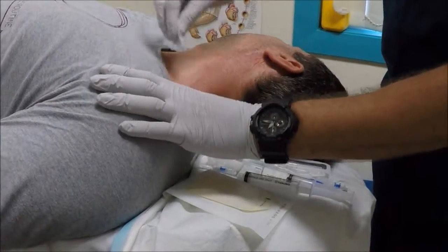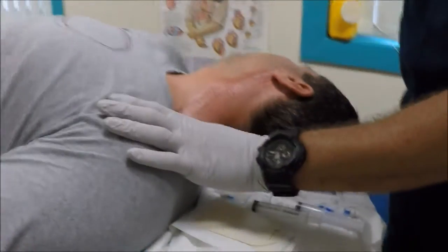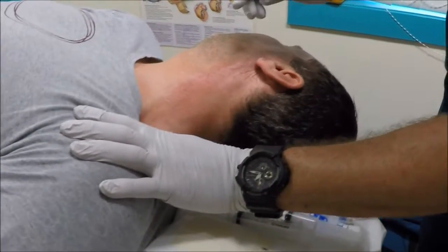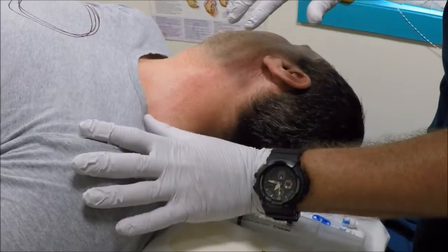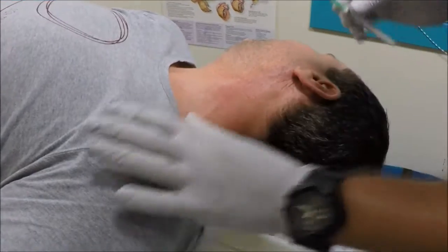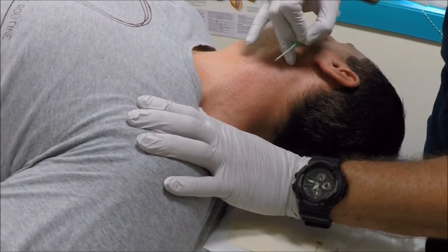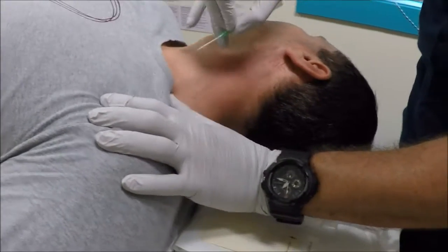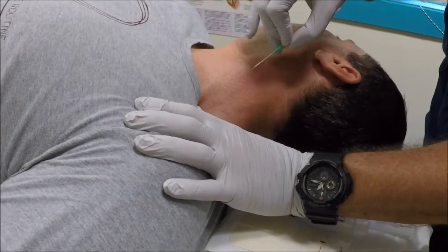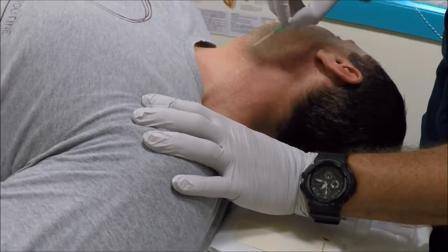As I explained before, we want aseptic technique, so we'll swab the EJ vein. I'm going to use my finger to occlude it at the area of the clavicle. It's my 18 gauge cannula. I would come in at a 15-degree angle, approximately halfway between the angle of the mandible and the clavicle. It's a dangerous cannulation position because your finger is actually in front of the line of the cannula, which is not a normal procedure.